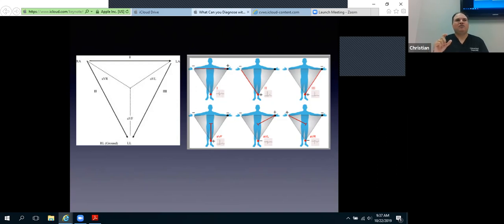And this is how you know to remember what's diagnostic about a 12 lead, and why a 3 lead and a 5 lead are not diagnostic. Because you're not walking around the entire heart. The 12 lead technically isn't walking around the entire heart either, because you need to consider posterior infarcts and also right ventricular infarcts. So this is where you have 15 lead and 18 lead EKGs.